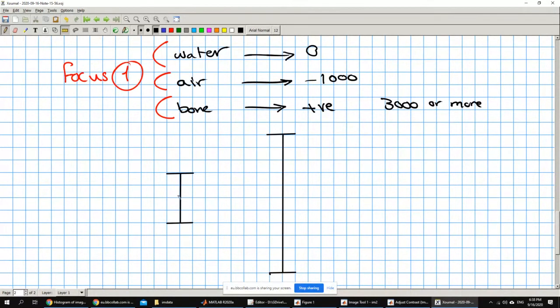Okay, basically this is from 0 to 255. This can be from negative 1000, say, to 3000, for example. You cannot do this mapping. If you do this mapping literally, like what we saw, and do this kind of scaling, so minus 1000 becomes 0, and 3000 becomes 255, and you compress everything in that range to be within that range.